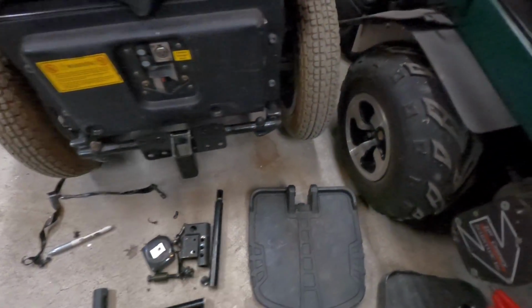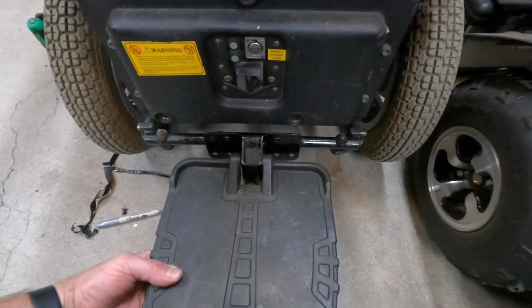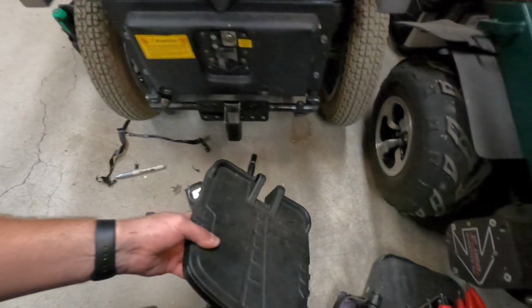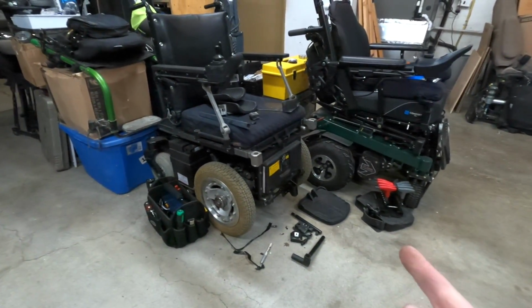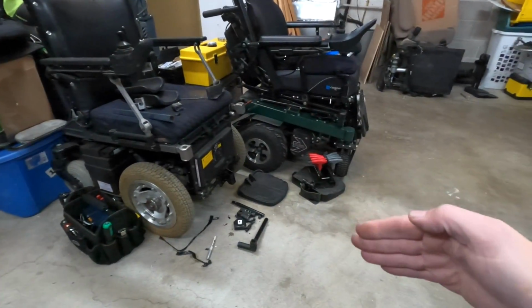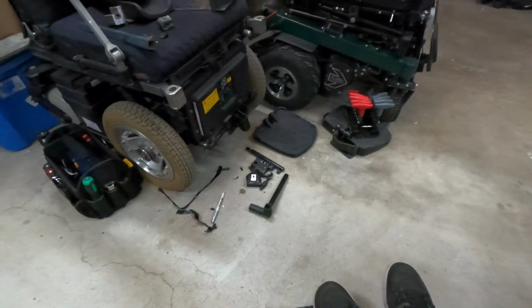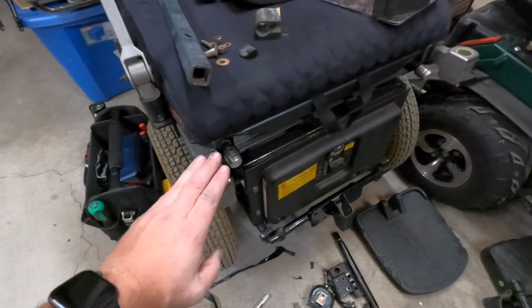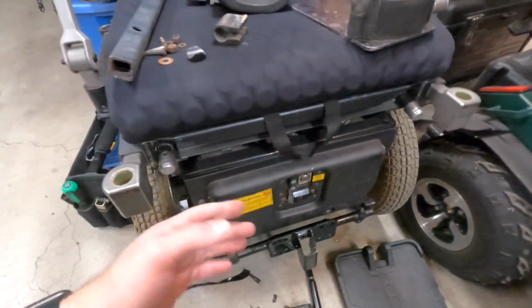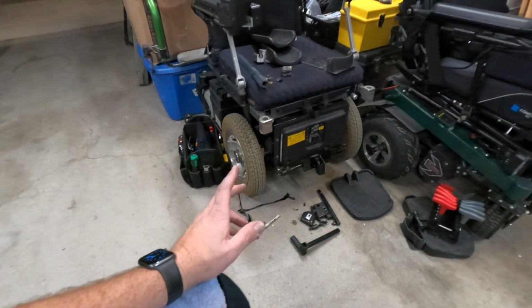We're just waiting for the paint to dry right now, and then once that's done, we can jam this guy on here, and we will have foot plates that will flip up. And like I was saying before, for me on the omegatrac, it'll be nice to not have the giant leg rests that stick out. These ones here. And then also, I'll be able to remove these mounts as well, and also these actuators here that used to let the legs tilt. We're not height adjustable anymore, but that's fine.